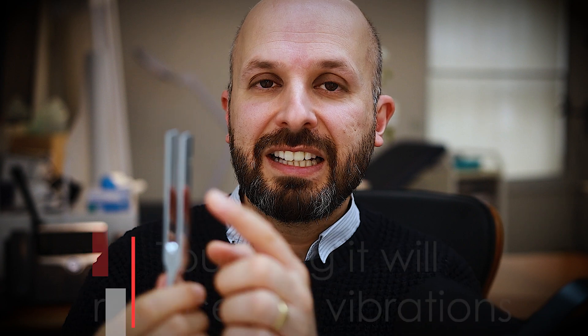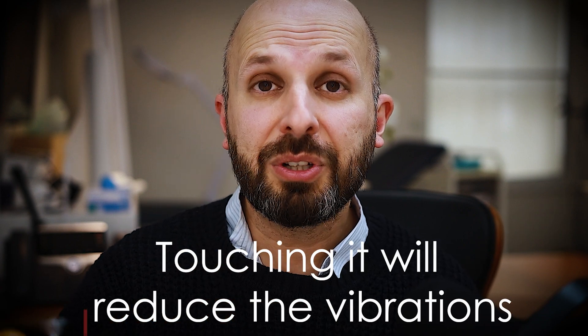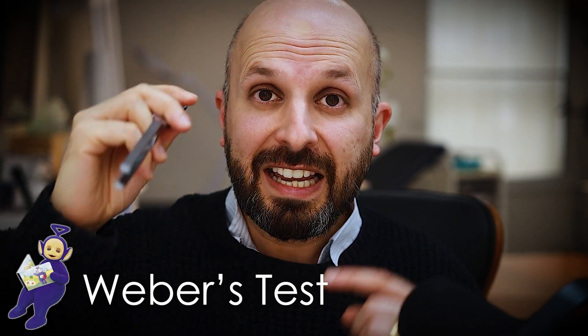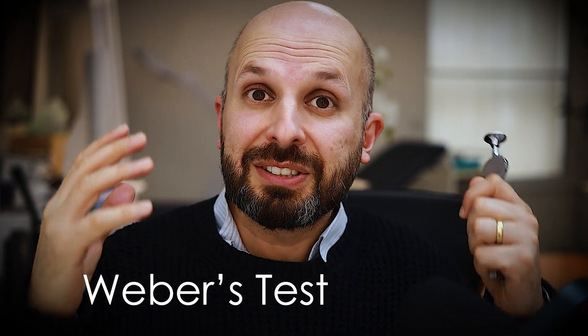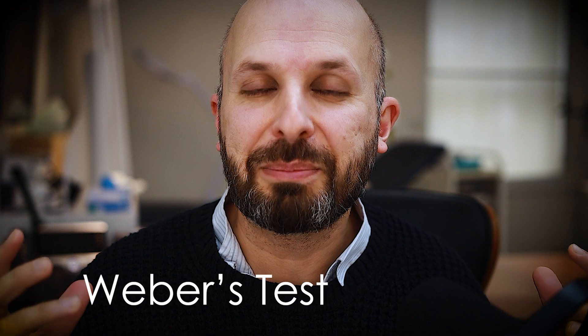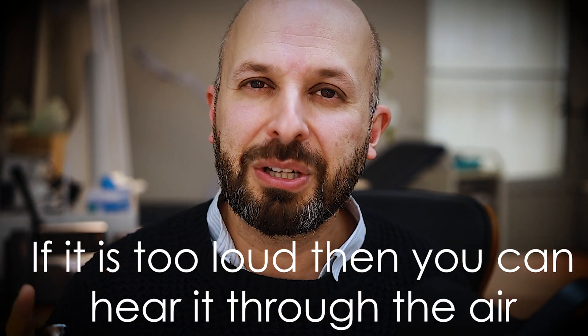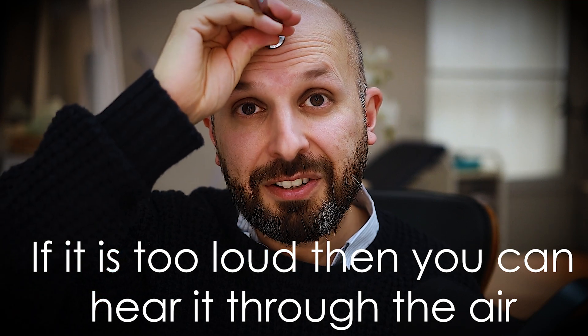The first thing I should say is you're meant to be able to just about hear the tuning fork when it's very close to your ear. You shouldn't be able to hear it in front of you like this. I see an awful lot of people whacking it against the table. If you can hear it through both of your ears like that, it's not going to work. You need it to be quiet enough. The way I do it is you whack it against your knee, then keep touching it so you can't hear it anymore. When you can't hear it, that's when you press it into the center of your skull really hard so you can actually hear the transmission of the sound. It's vibrating your skull and that's how your ears are picking it up. If it's too loud, you're going to mix up the results, so it has to be just through vibration that you can hear it.